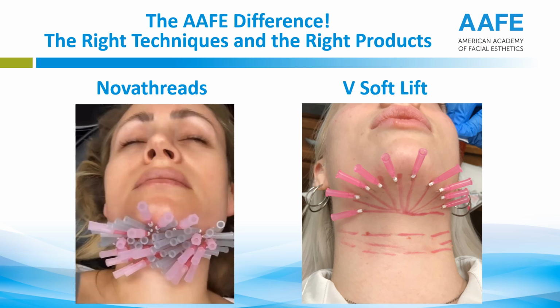Under the chin, by the way, and neck is some of the best areas to treat, because, and I'm going to throw out a concept that will surprise a lot of you, under the chin you get skin tightening, collagen biostimulation, and permanent fat removal. Does that sound like another product, deoxycholic acid, that you inject down there? Through the mechanical action of those threads going in, you will permanently remove fat, but you also get collagen production and skin tightening.